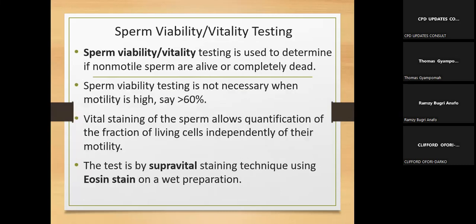I think this place, you've said it already, the fact that the testing is determining whether the immotile ones are actually dead or alive. And the fact that you need to do the test only when the motility is less than 40% and immotility is more than 60%.